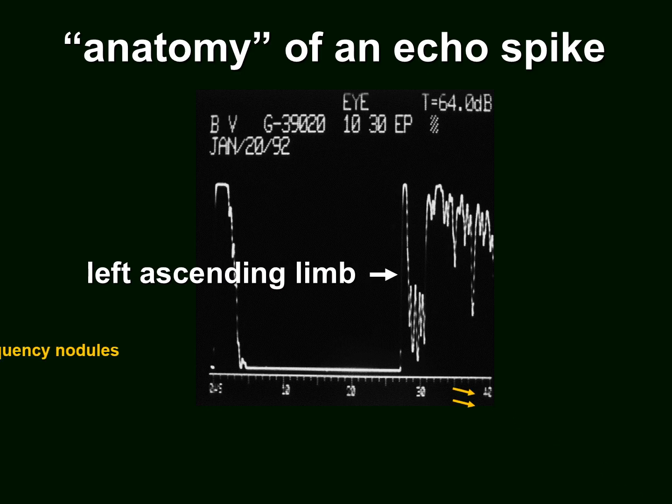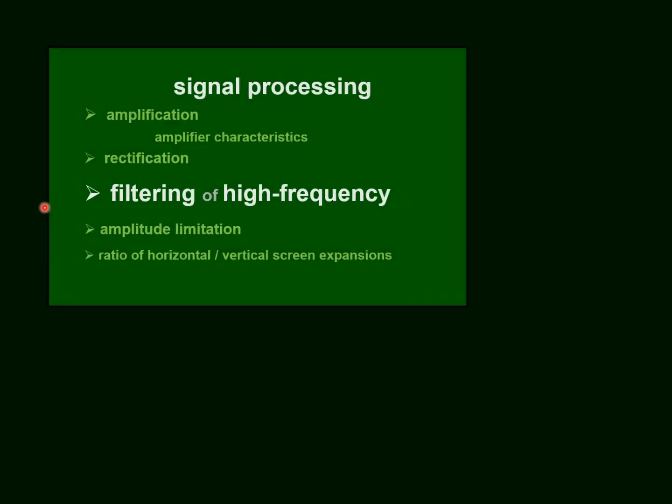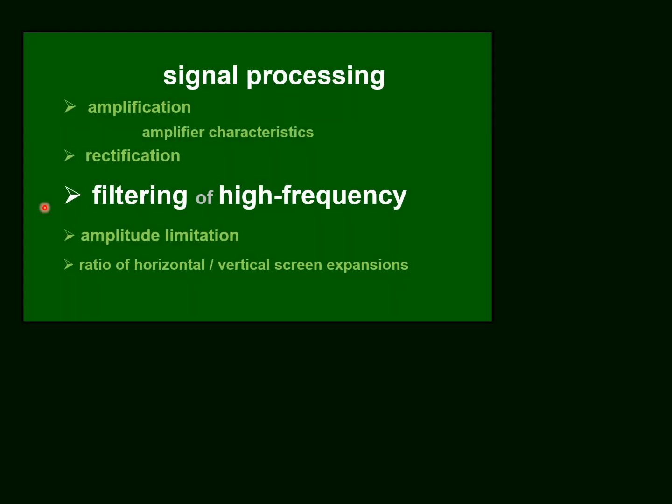It's the left ascending limb. The filtering of the high-frequency oscillations is an important part of the signal processing.